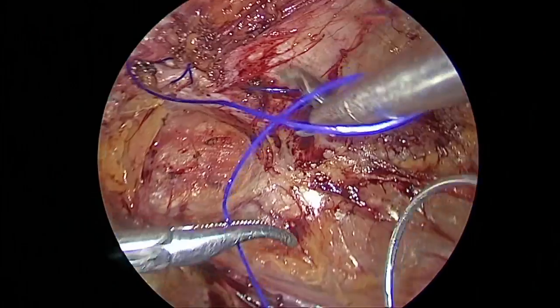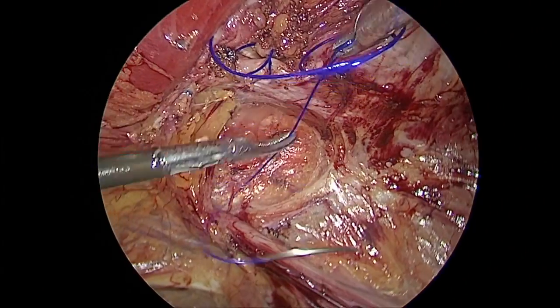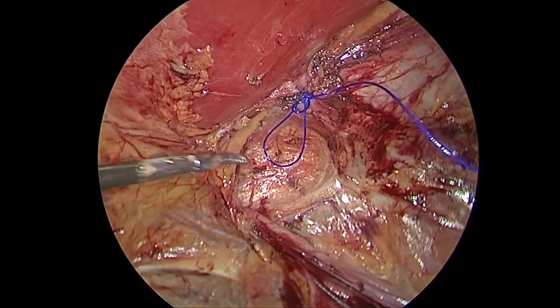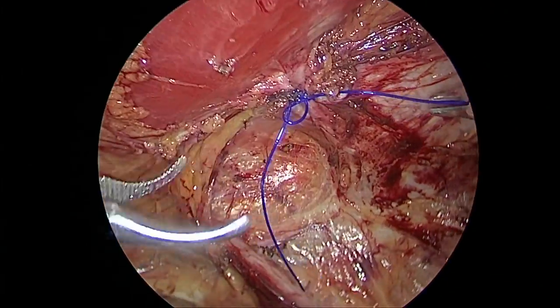and then once the closure is performed well, you can put in a mesh here.